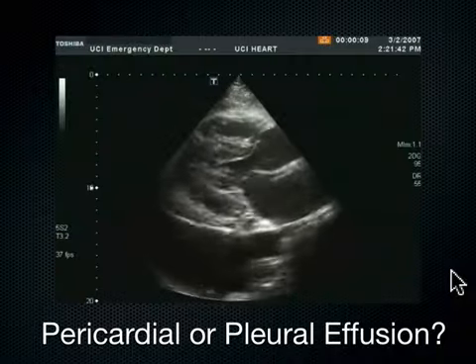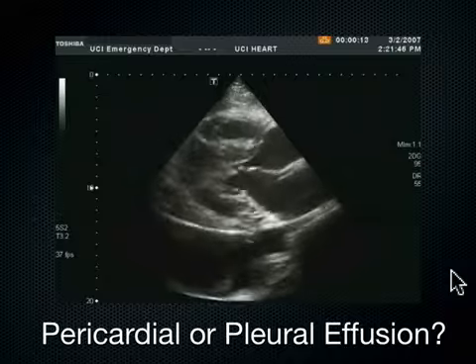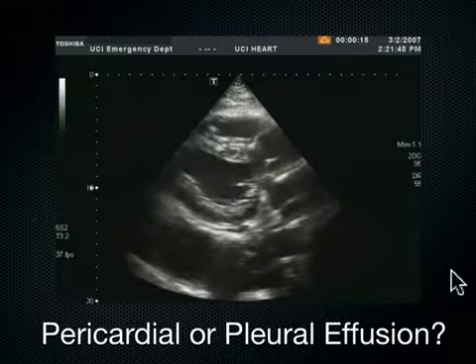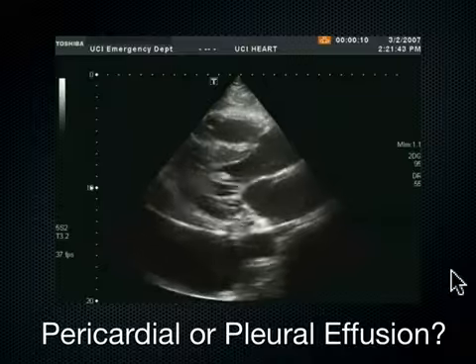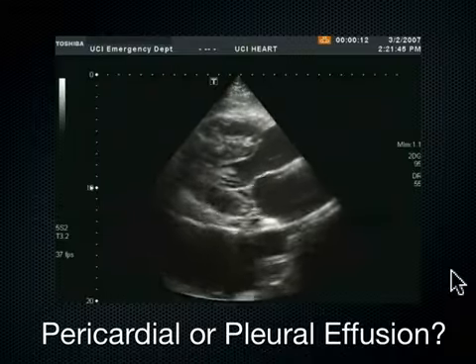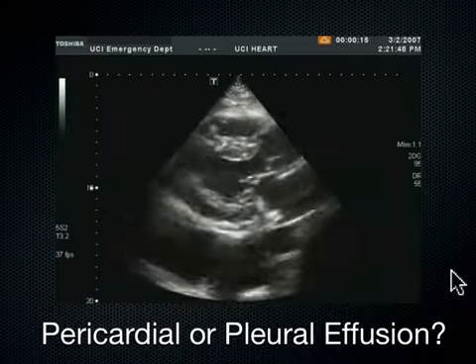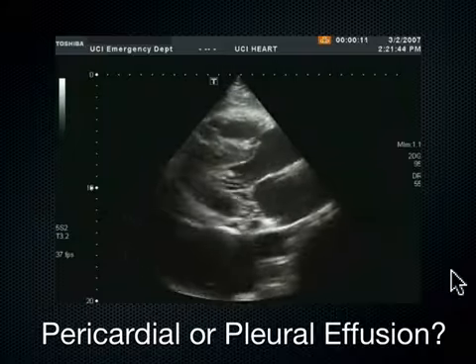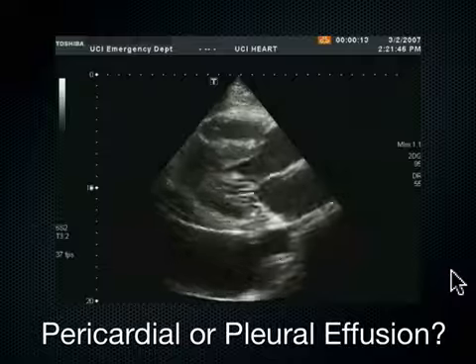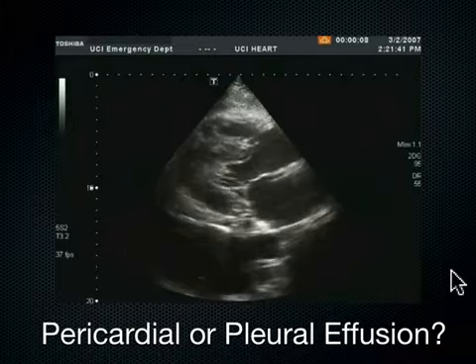If it wasn't for that descending aorta, how do I normally diagnose pleural effusion on the left? Simple. I go into my FAST exam window, looking at the spleen and the diaphragm. I look superior to the diaphragm, and if I don't see the mirror image artifact of the spleen up in the chest, if I see all this black stuff on top of the diaphragm, looking coronally, laterally with the P21 probe, then I know, with the same probe I'm using for this, that this confirms to me that this is pleural. I always do that.